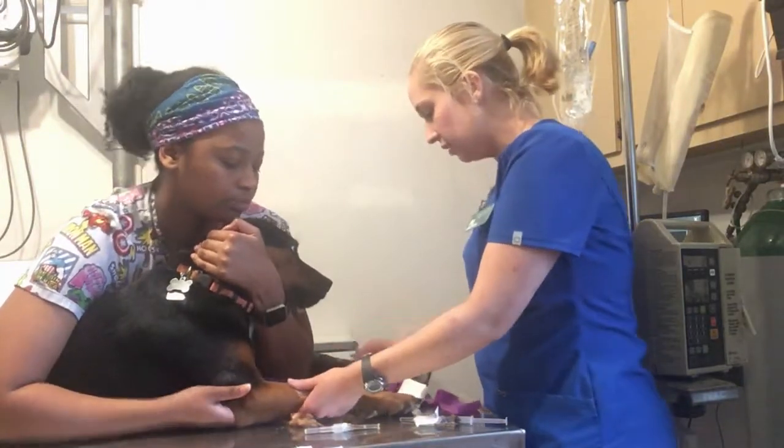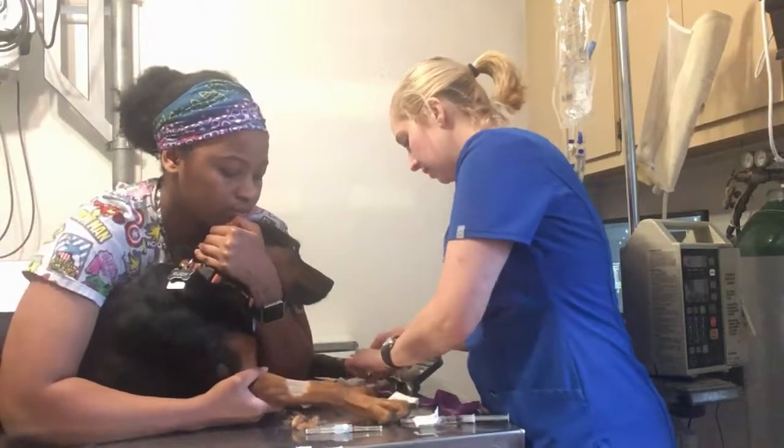Then I'm going to go ahead and do a quick scrub on the area.